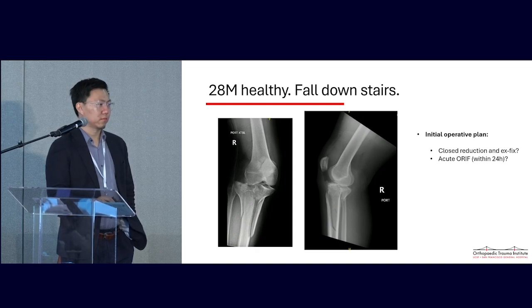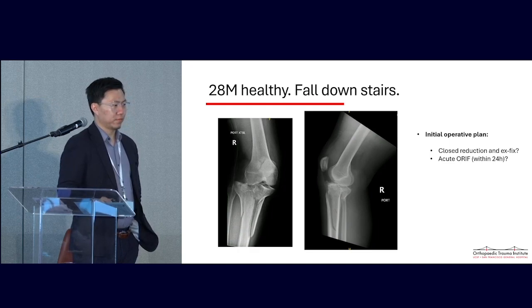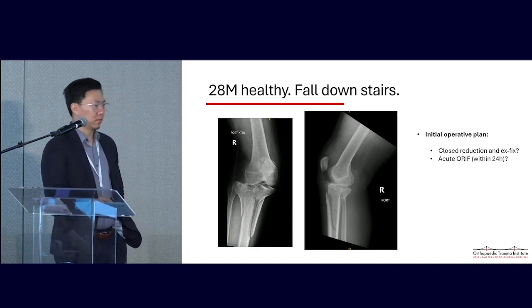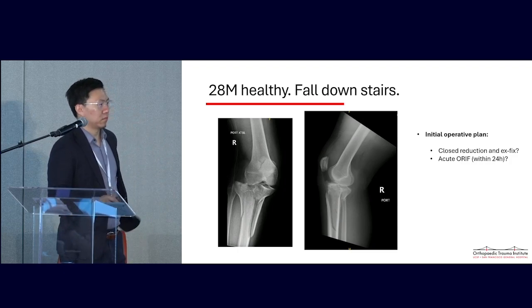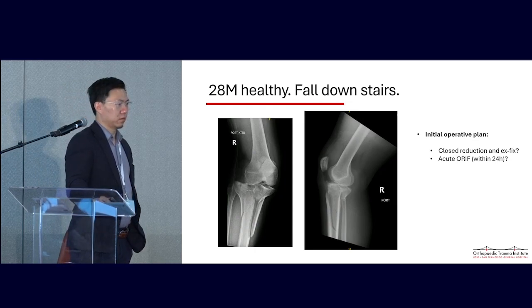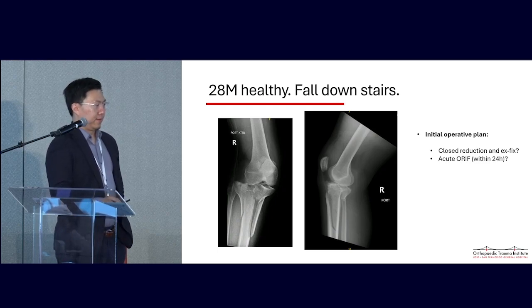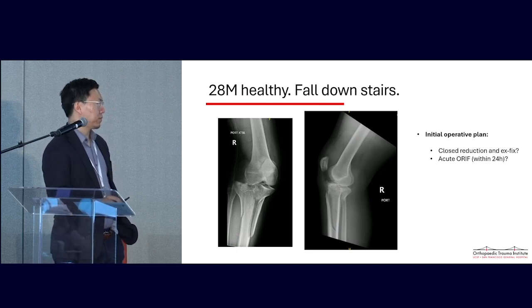I don't use a lot of spanning X-fixes for femurs and tibias at the knee. I use them a lot for pilons because they help me get my reduction later on. This is something I would use because it's not reduced well and you don't want to leave it like that. There's significant potential for shortening, so a spanning X-fix is beneficial. Again, anteromedially with the pins, because thou shalt not varus. And that's where my femoral distractor comes in.